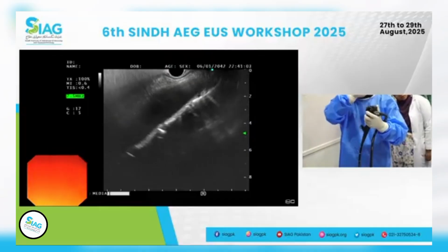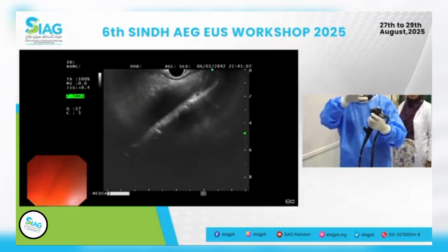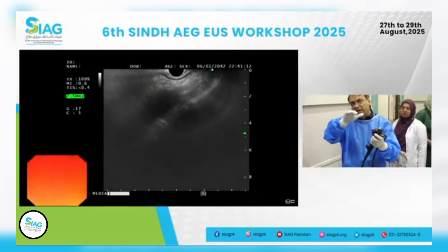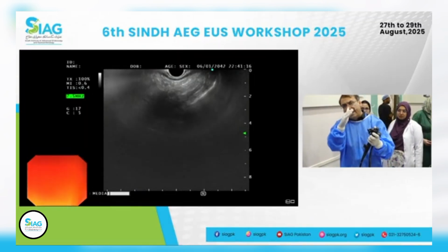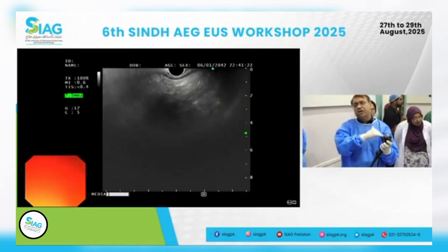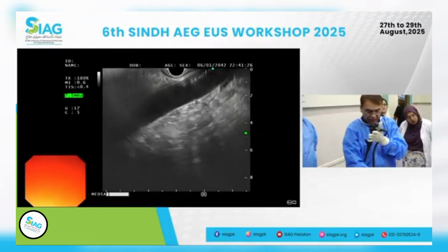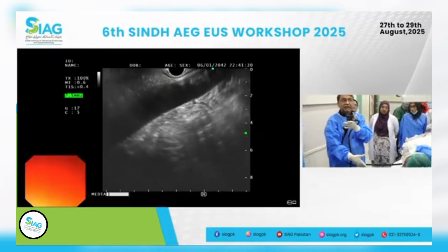From that area, from the stomach, found the liver, pull the big wheel towards me, pull the scope back, 2/3 of the liver is on the left, 1/3 on the right. Your scope is rotating to the right, and then from 180 degrees, now your scope is going from 180 to 90 degrees. That will take you to the aorta. Once you have the aorta, scope is still straight. I'm really staying away from the patient.